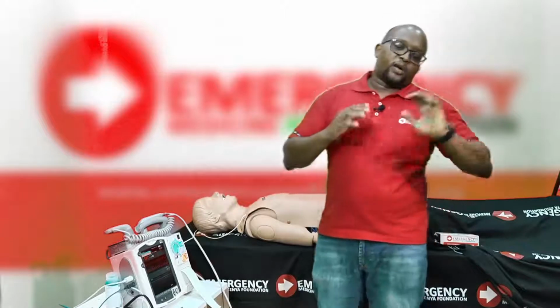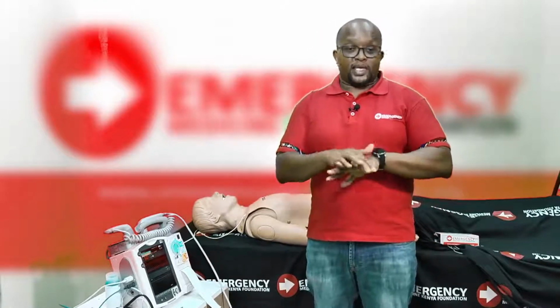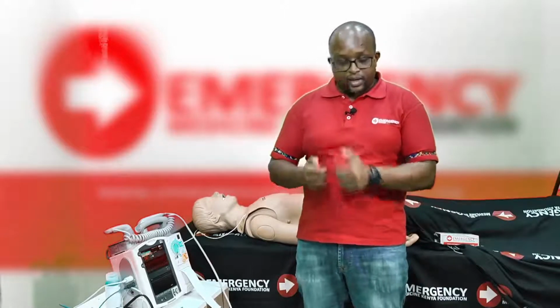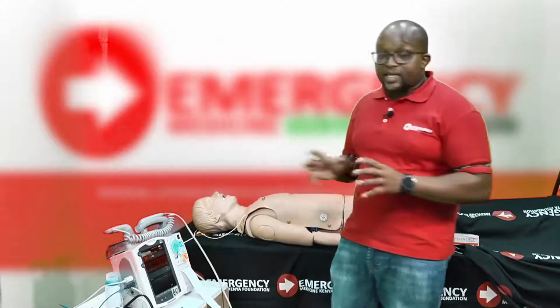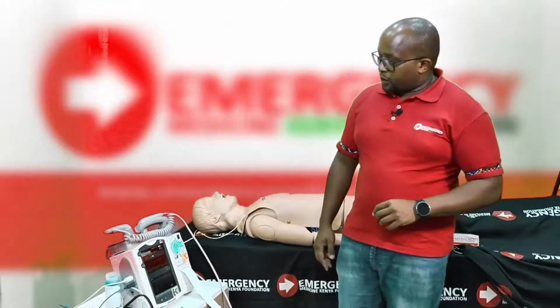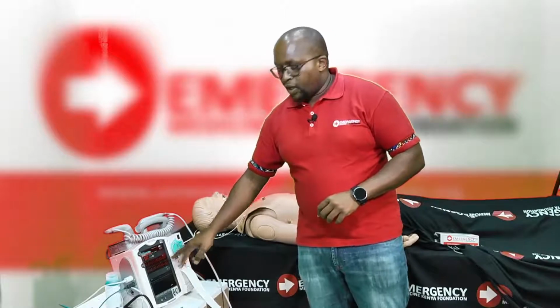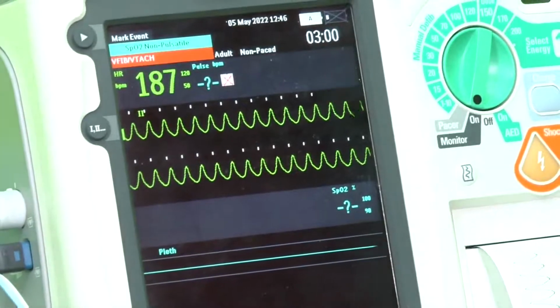All right, now it's very easy to cardiovert a patient, okay? All you need to remember is SMSs, okay? Remember when we used to send SMSs on the phone? So the first S is sync, okay? There's a sync button, so you want to press the sync button, and the moment you press it, you will see on your screen, it should say sync. That's the first thing, SMS, sync.